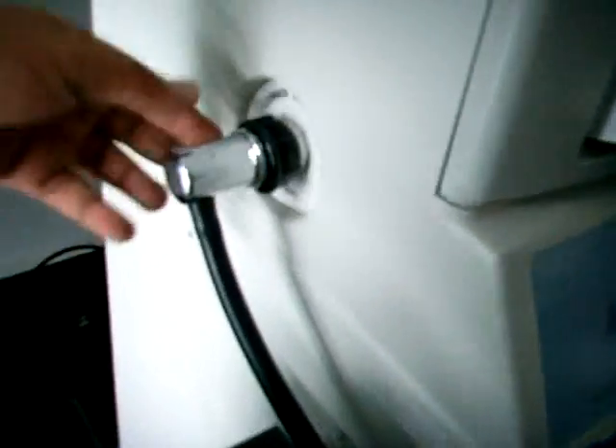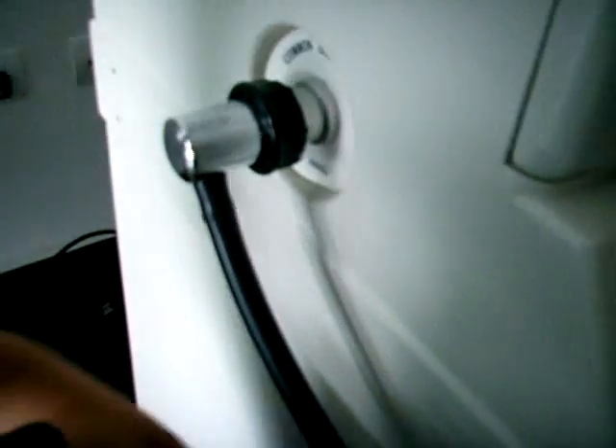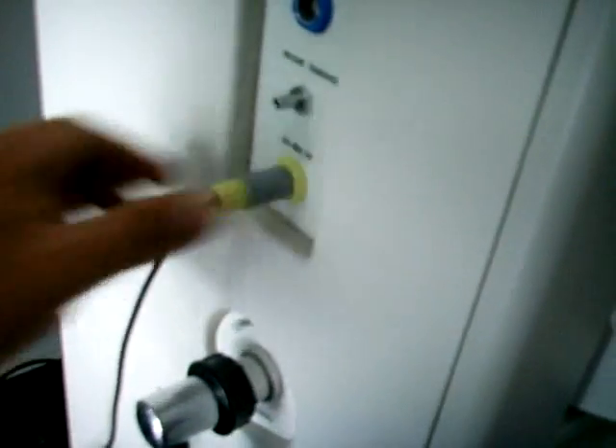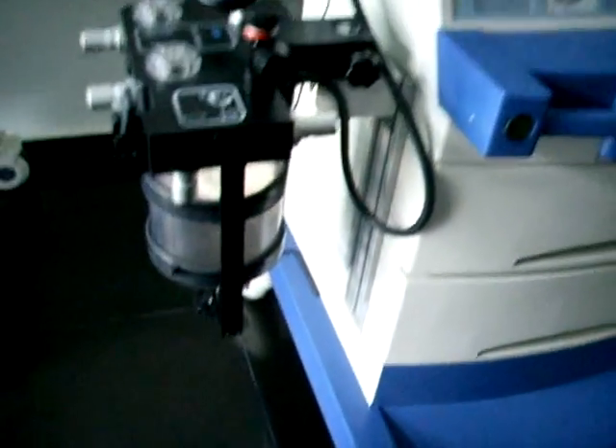La manguera del canister debe ser conectada al lado izquierdo de la máquina de anestesia y asegurada por el acople tipo rosca. De igual manera conectamos el cable al conector amarillo del lado izquierdo de la máquina de anestesia. Es así la forma como nosotros realizamos esta instalación.